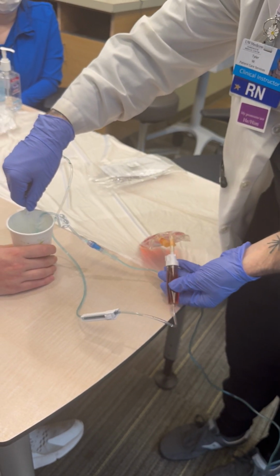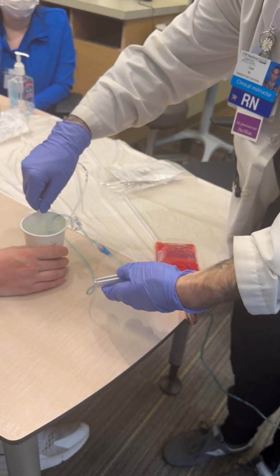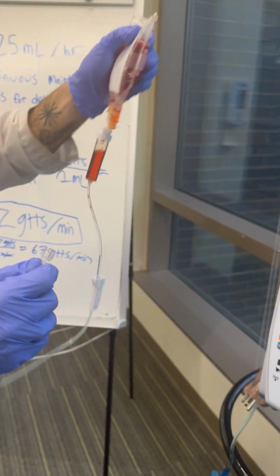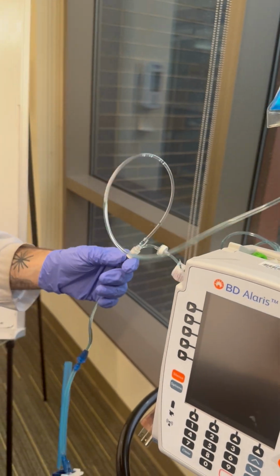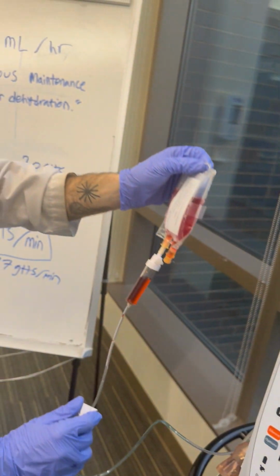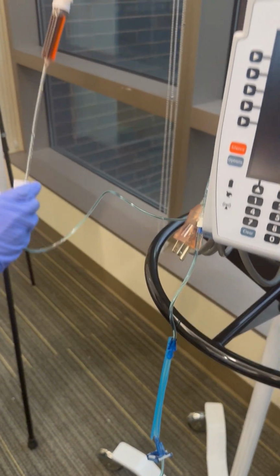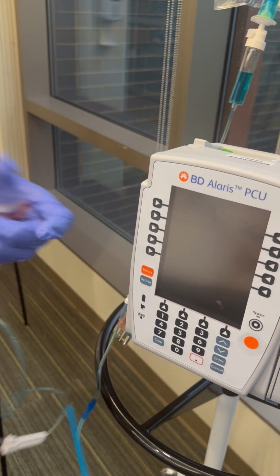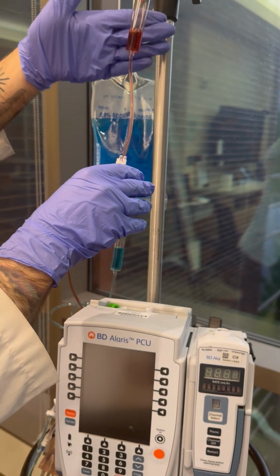And again, this isn't something you do at bedside. I'm just doing this to show kind of the example. So anyway, you want to be able to see the drips. So put this all back up here. Yeah, it's going to do it again, so I don't want to do that. Tell you what, let's see. There we go. All right, we're back. Okay. All right. So there, back to this.